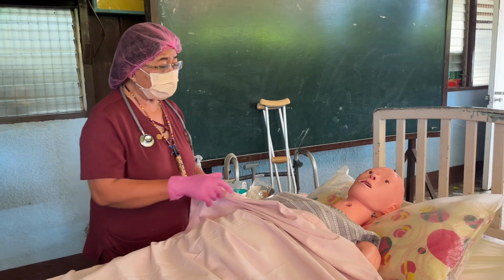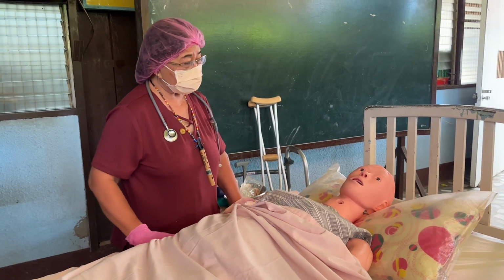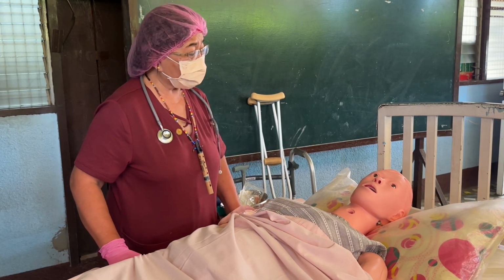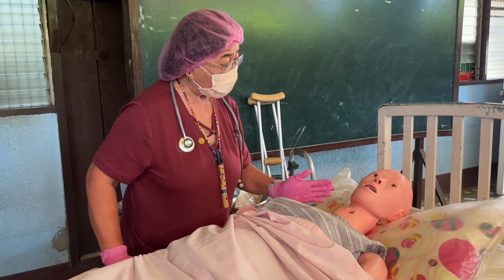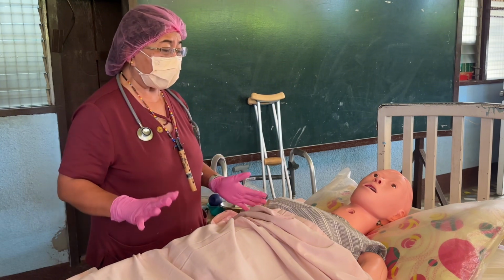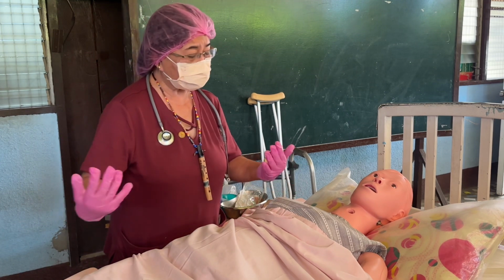Ma'am, I'm going to insert a nasogastric tube through the doctor's order because you are very weak in eating your food. So to avoid malnourishment, you have to eat through the tube passing through your nose, mouth, and going to your stomach. Is it okay for you, ma'am? Yes. Okay. So, before that, ma'am, I'm going to check the vital signs. Okay, everything is fine. Then, I'm going to raise the side rails and lock.